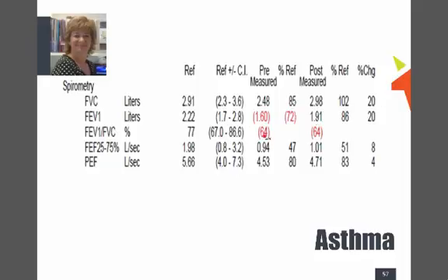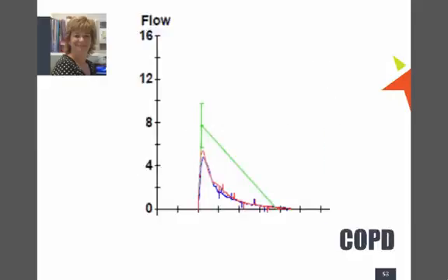The reason this person's still got a little bit of obstruction is probably because their treatment's not totally optimized yet, or it's a chronic asthmatic who will end up probably in that chronic obstructive pulmonary disease basket. That's where it gets a bit complicated. But this person's got a good response, 20%, 200 mils is asthma. Let's not make it complicated, and I would treat that as asthma.